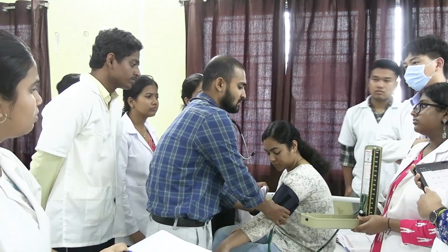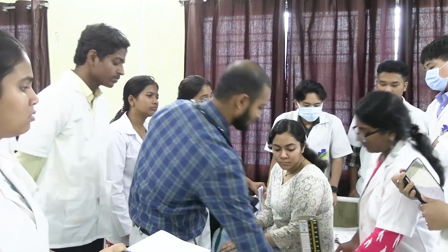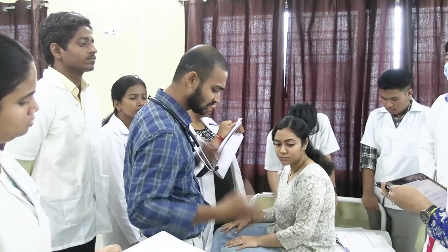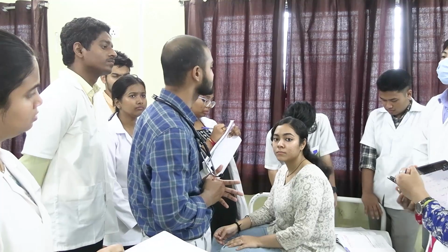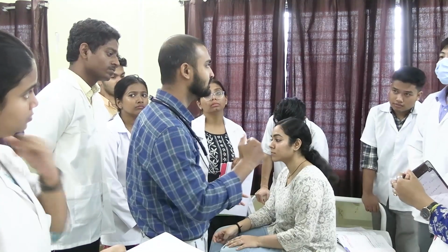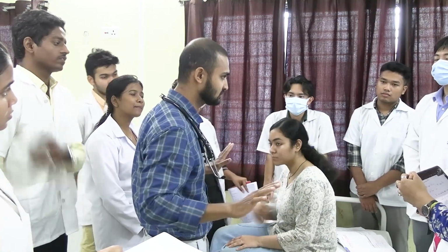So here it came around 110 by 80. Okay. So this is the auscultatory method. When you are inflating the cuff, at the lowest point there will be silence first, when you start from 0. At a certain point you will get the beat. Again after a certain point the beat will diminish or be absent, or there will be complete silence.